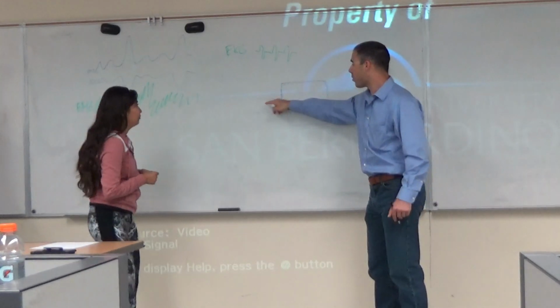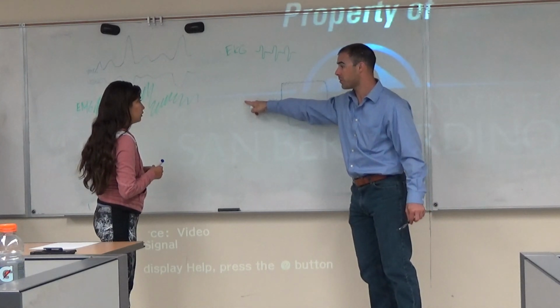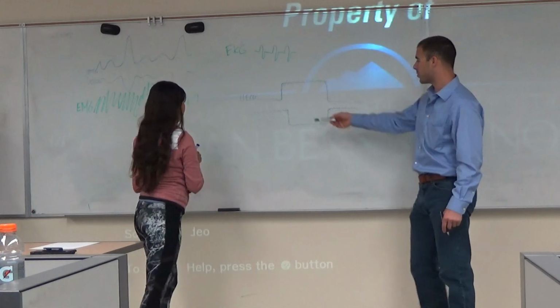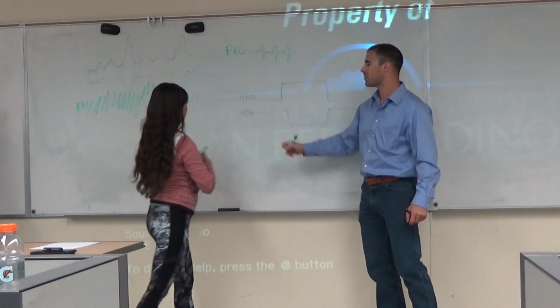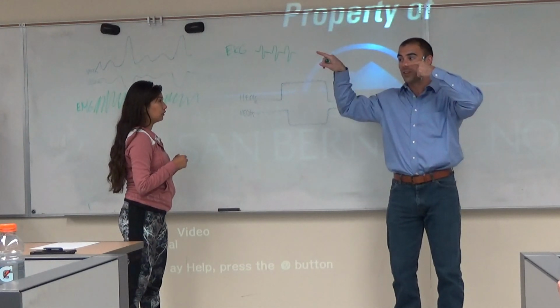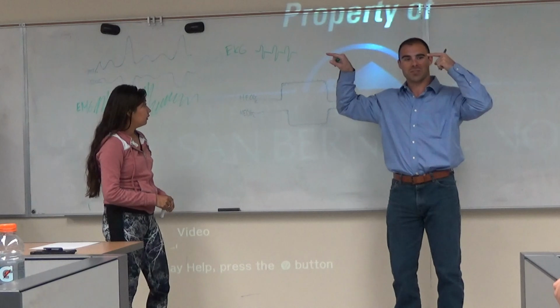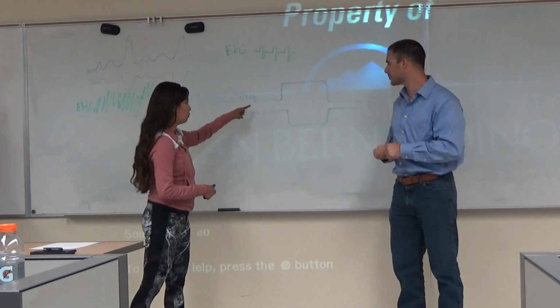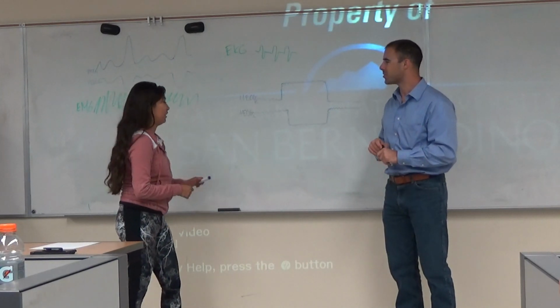So if you're going to measure horizontal eye movements, which is what saccades are, these change a little bit. It's a different site that we're recording from. It would be an HEOG. And in fact, you could even label them right and left, or R and L, because you would have one on each side. When you look this way, one eye is going to contract and one is going to relax a little bit, so they're going to be in opposite directions. Would R and L be subscript? Either way, you can do it however you want. Good job. All right.